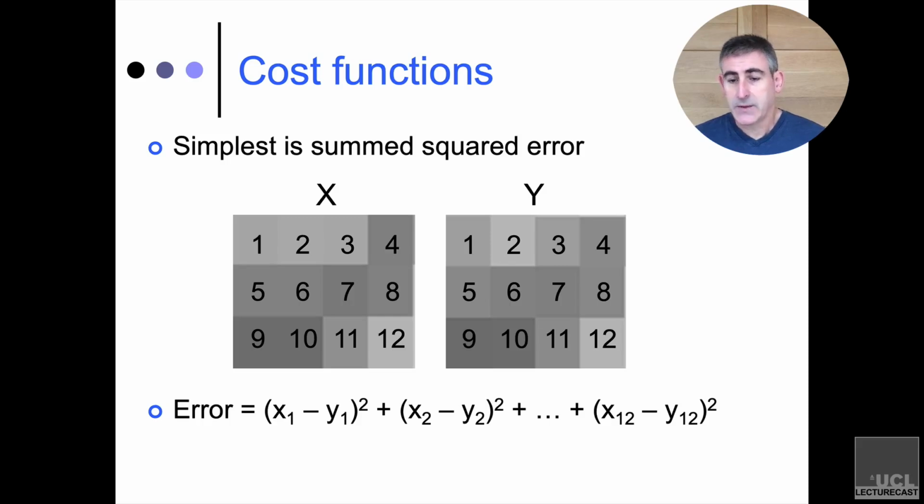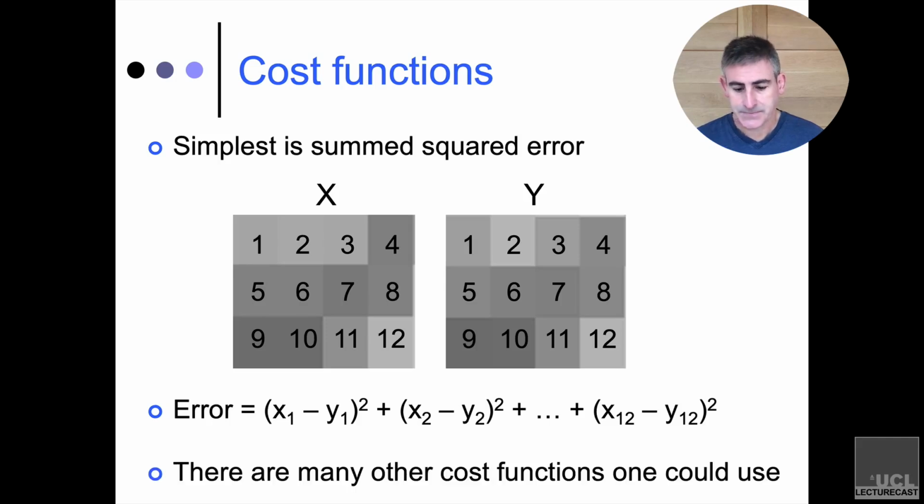And what you can do is say, okay, well, then for any two images, I can compute the cost function, right? So I can get an error score. And what I want to do is make that error score as close to 0 as possible. Because if it was 0, it would mean the two images were perfectly aligned, and the difference between them would be nothing. You never really get it to 0 because, of course, there's other things that are going on in the image that have nothing to do with head motion. It's just that head motion is such a big effect that this will be the dominant source of error, and that's why we want to minimize it.